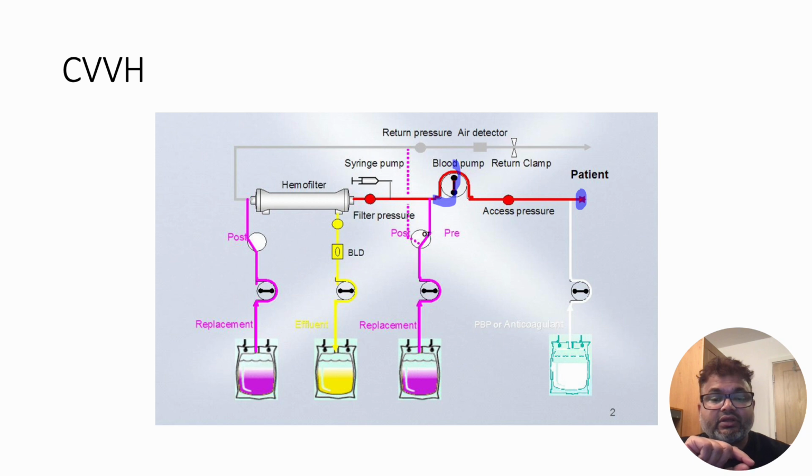But because blood is concentrated, there are lots of solute, so there will be more effective solvent drag in case of post filter replacement fluid.